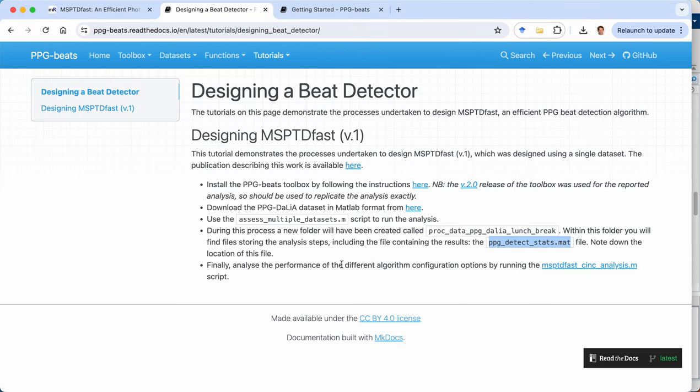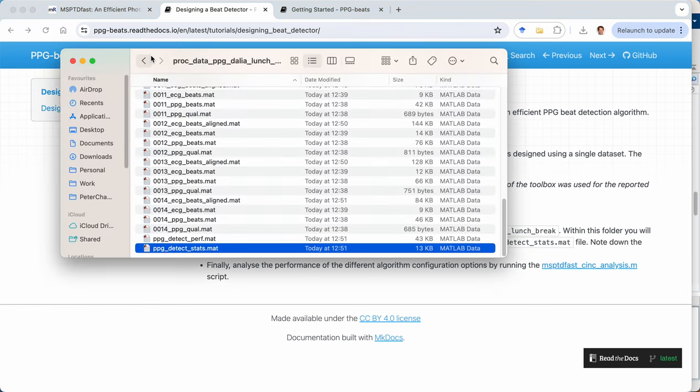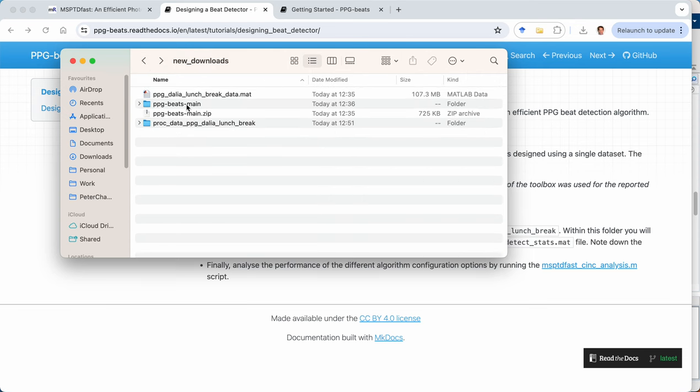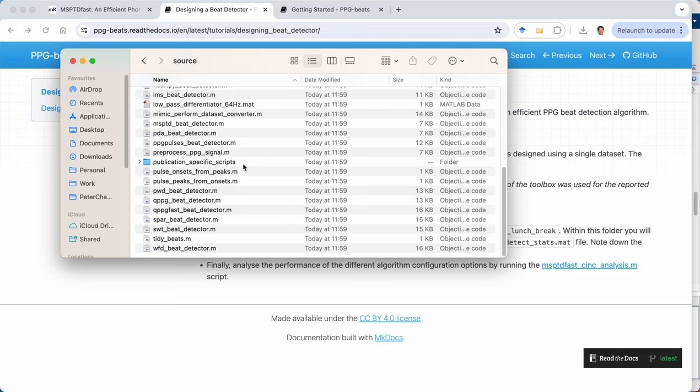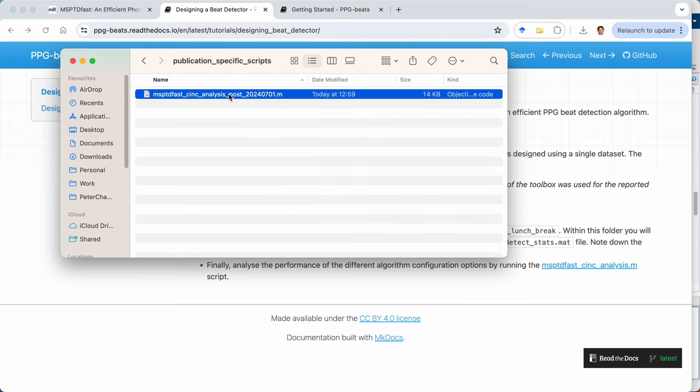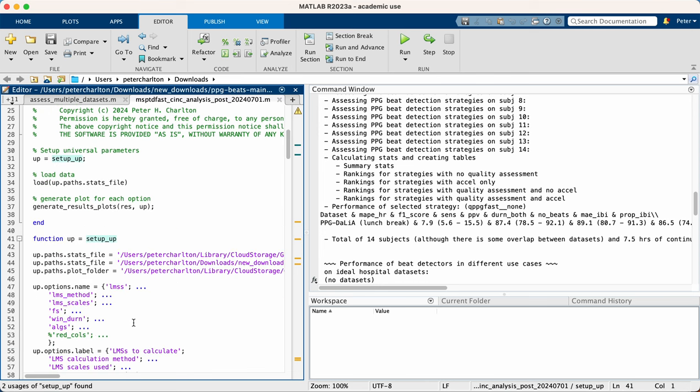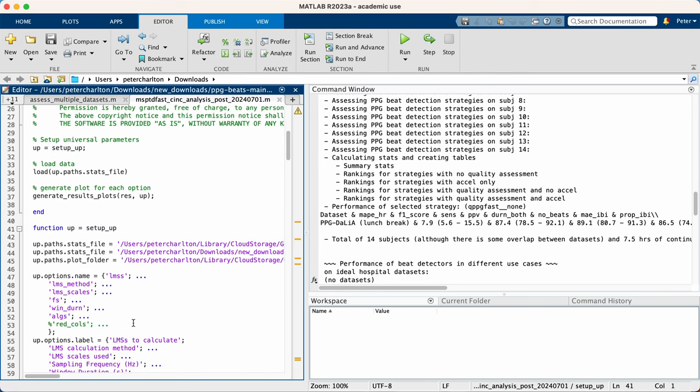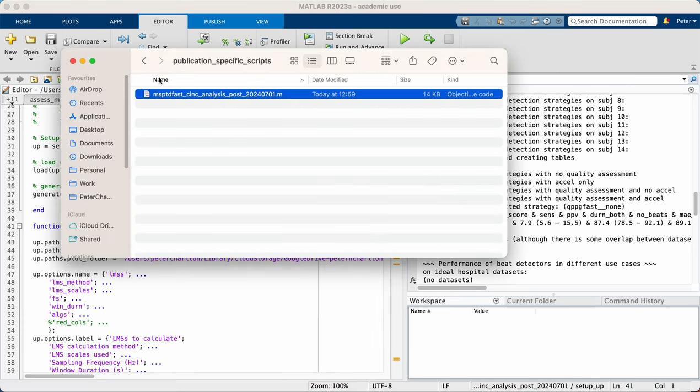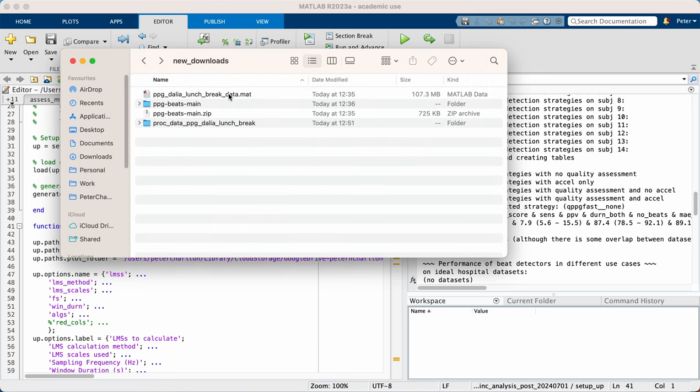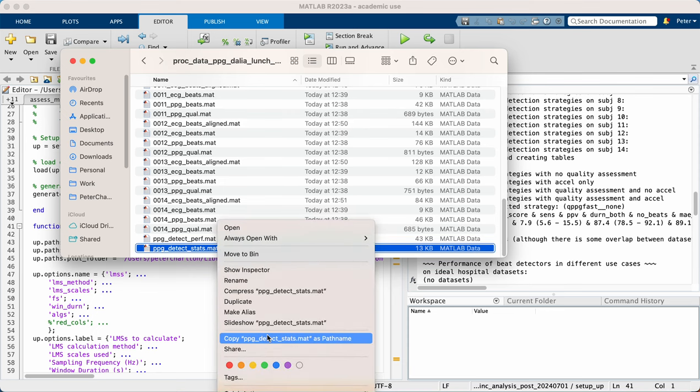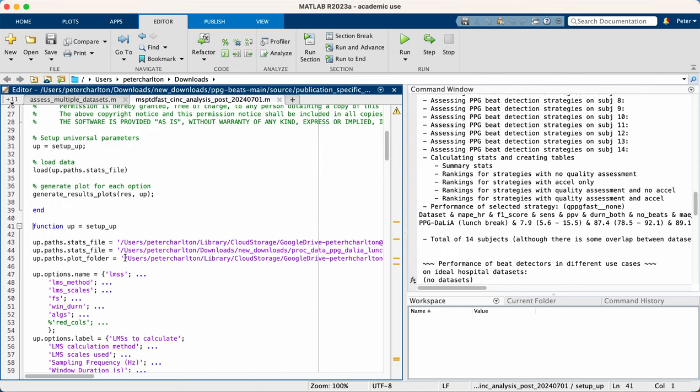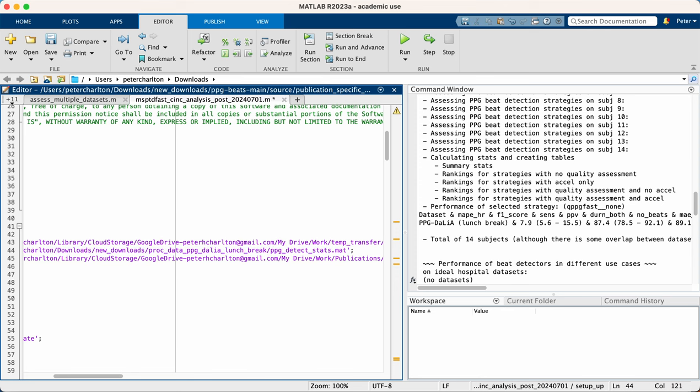Now we're going to analyze those different statistics by running this final MATLAB script, which is contained within the toolbox. So going back into the toolbox folder, into the source folder, we have some publication specific scripts. And we're going to open this one here. And we, as before, need to specify the paths for firstly the statistics file. So let's grab the path for that. Here we go. So we'll insert that there.